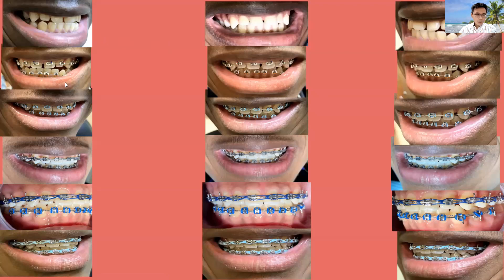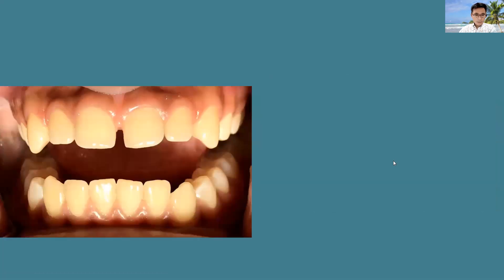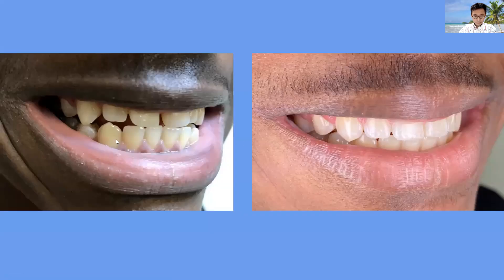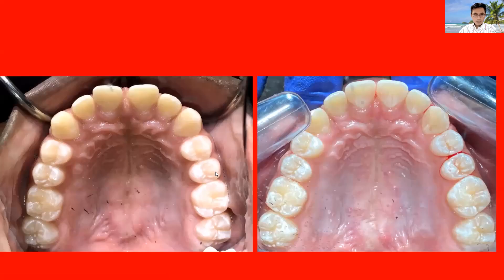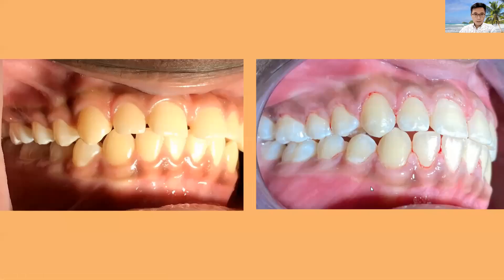Here are pictures collected from when we started, when brackets were placed, and then the final result. This is before and this is after — the gums show some bleeding because we did cleaning right after removal. You can see great improvement with the gap. We didn't use any veneer or composite, just orthodontic movement. The big gaps are now closed with no gap remaining. The arches are aligned very smoothly, as seen in the side-view photos showing before and after.